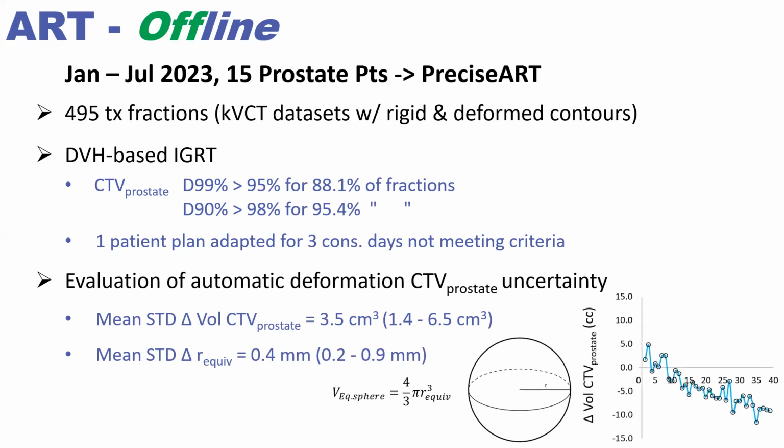But when you look more closely, this is just one patient. And if I showed you all the patients, essentially most of them show an edema period, followed by a slow decline in actual volumes. And so at first we thought we were seeing errors, and then we thought, well, this is probably actually following it, maybe a physiological process.